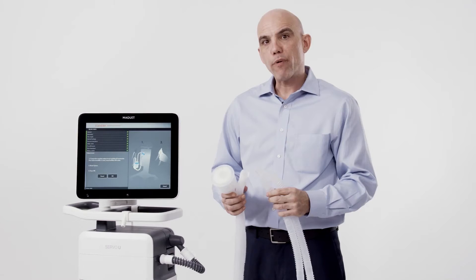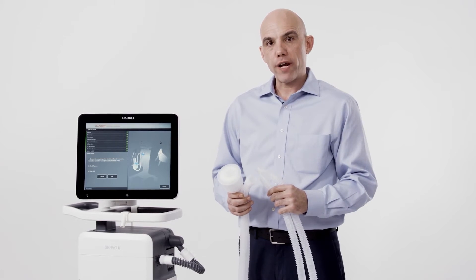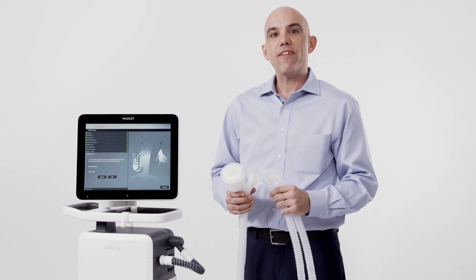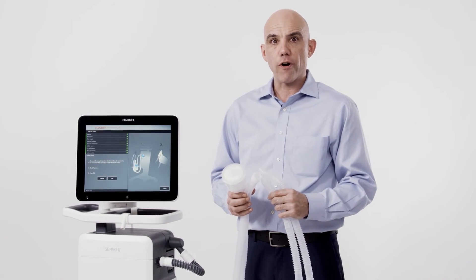The final step of the pre-use check is the circuit test. It's important to use the circuit, filters, and any accessories that you plan to utilize with the patient. If an active humidification system is going to be used, assure the humidifier is set to off and the chamber is full of water.